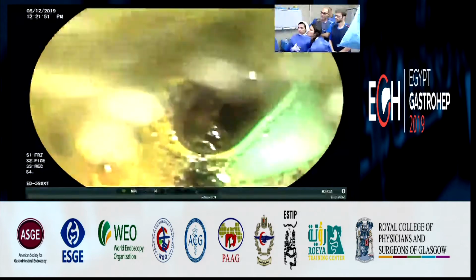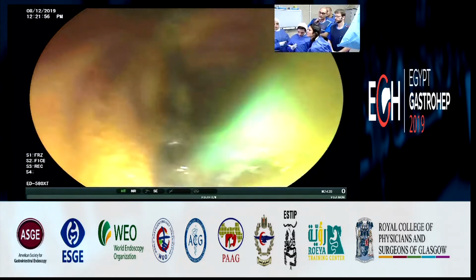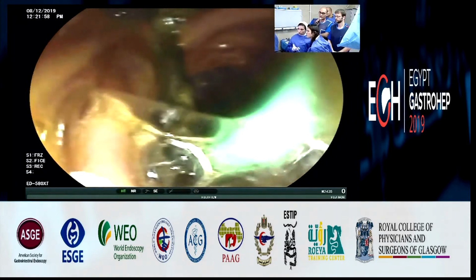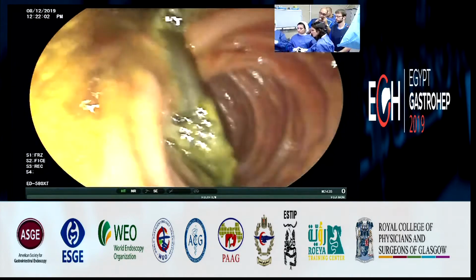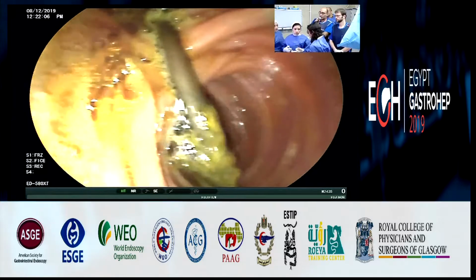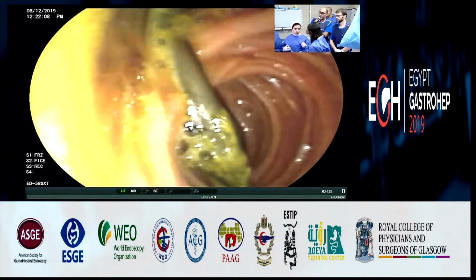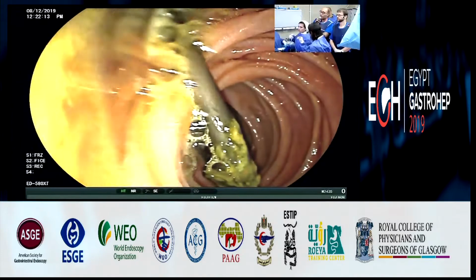We inserted a plastic stent in the confluence, but after 3 months she had a cholangitis and occlusion of this stent, and we replaced it with another stent, but we also noticed there is still attenuation of the left intrahepatic biliary radical. After that we inserted a new stent, which is still present until now.